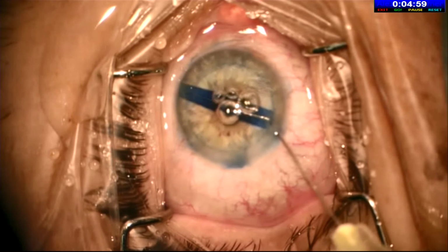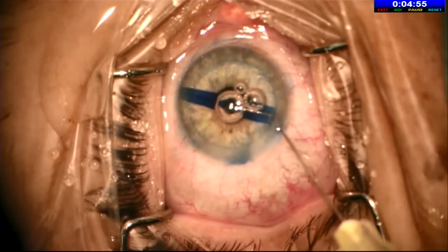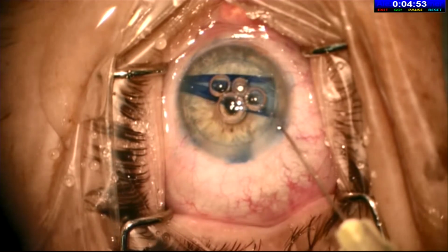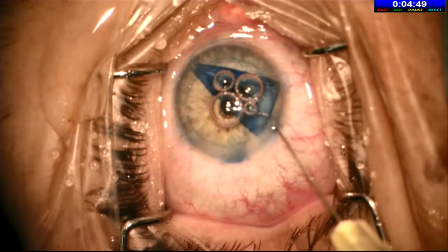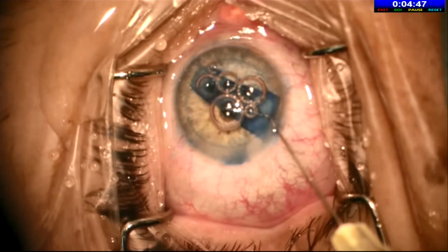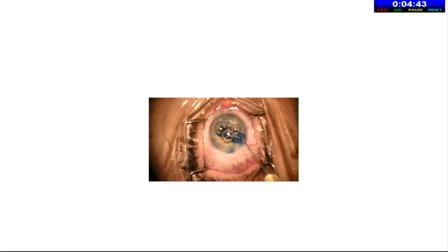Now here's a bit of a messy video. These are when we go back and look at our grafts which were placed upside down. So here again, with lots of air bubbles, which are a bit confusing, trying to open the graft, thinking that it's in the correct orientation and that the air bubbles are anterior to the graft. And then it wouldn't open because, of course, it's actually upside down, and then going in with a cannula and fooled by a false Moutsouris sign.